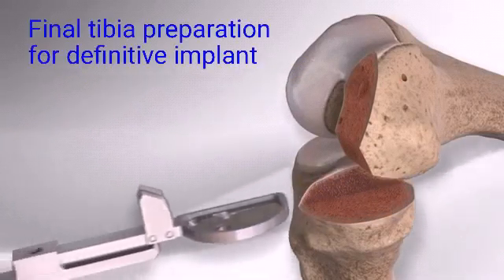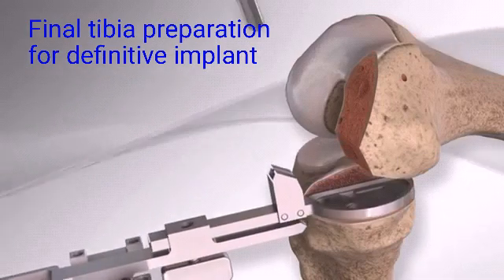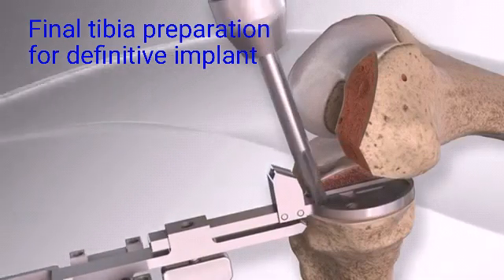The cut surface of the tibia undergoes final preparation to prepare the bone for the fixation posts on the backside of the tibial implant.